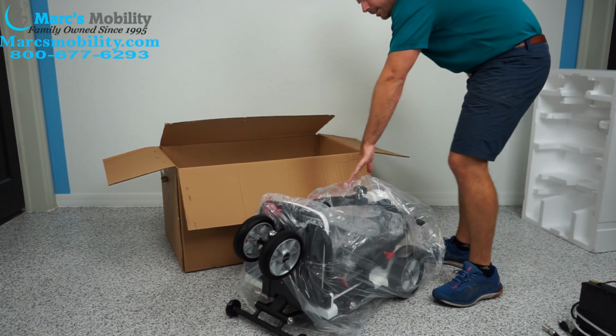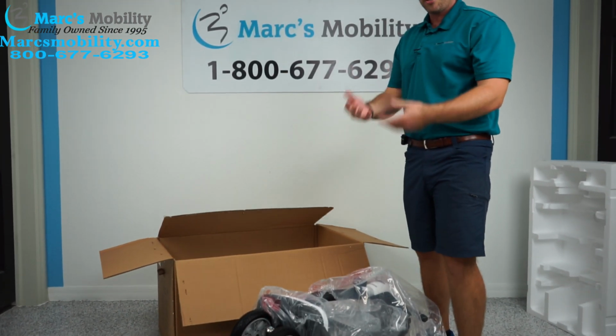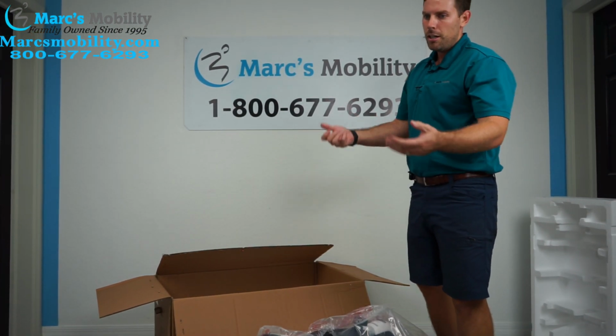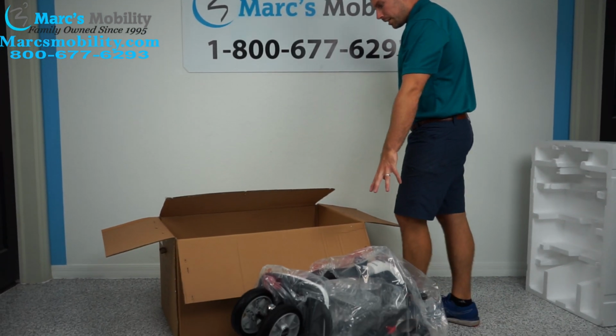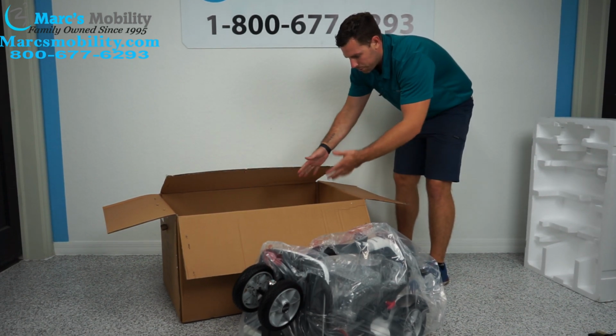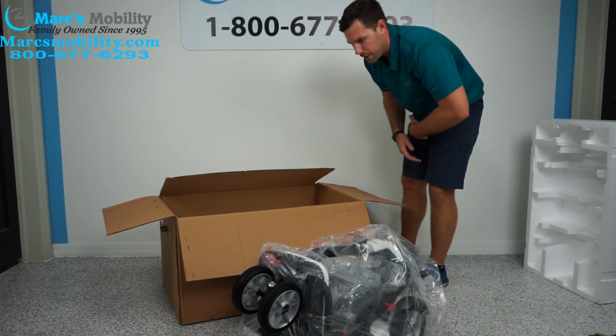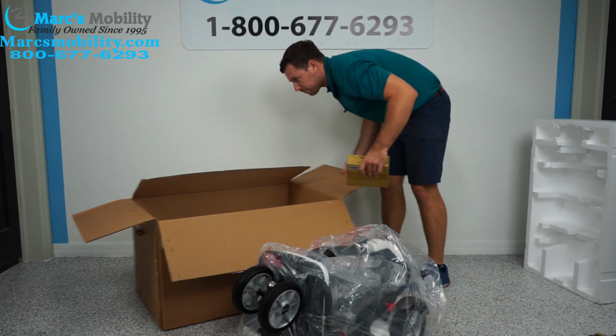Now this, with the lithium or with the sealed lead acid battery pack, the battery pack's about 18 pounds, the unit is 51 pounds, so if you do the math, you're close to 70 pounds. So if that is how you get it, you might want to just cut the box open, and then you can cut the foam out and get it out a little bit easier. But if you have two people, that's the easiest way. Just pick it up and take it right out of the box.